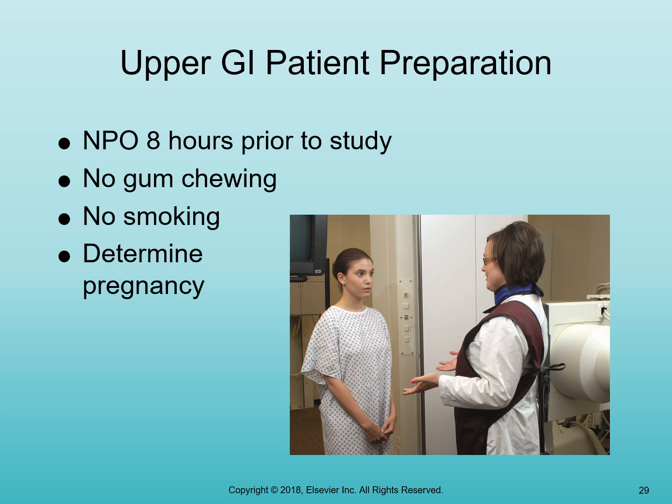Okay, so NPO 8 hours prior, no gum chewing, no smoking, and as always, we would determine pregnancy on the patient.